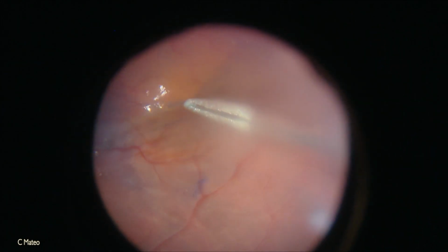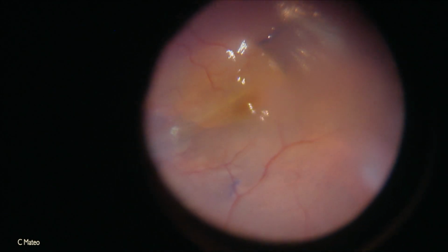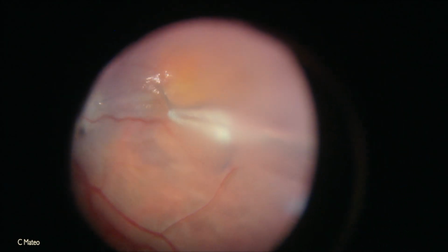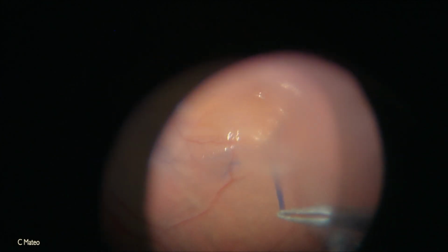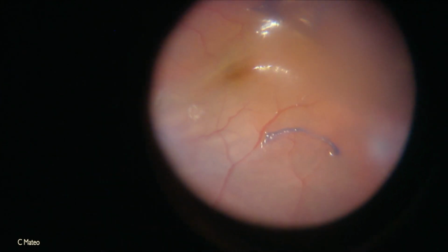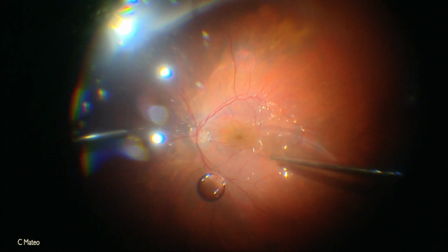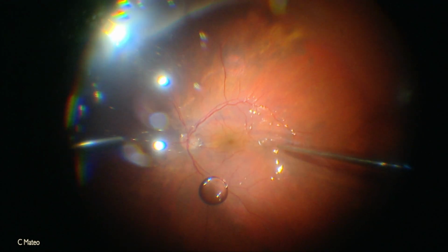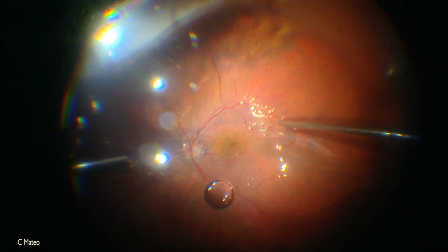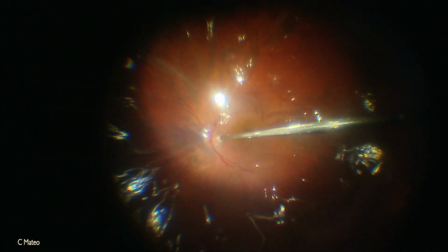Evidently, the internal limiting membrane could have been removed at the beginning of the procedure, before detaching the retina, but I'd rather do it in this step, preserving the rigidity of the retina when we detach it. And as you may see, perfluorocarbon liquid has pushed the subretinal fluid to the periphery. A small retinotomy is done as peripheral as possible in the superior temporal quadrant to drain as much as possible of the subretinal fluid. And at the end, SF6 10% is used to tamponade.